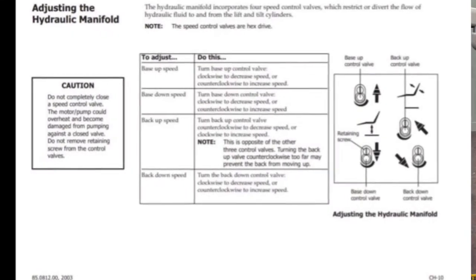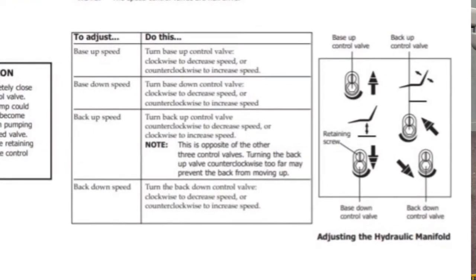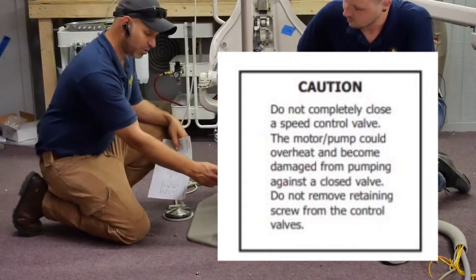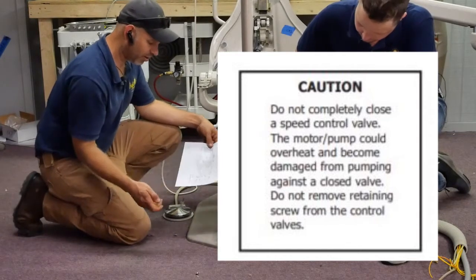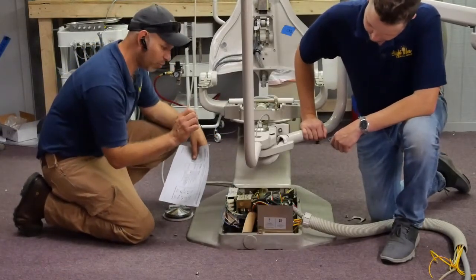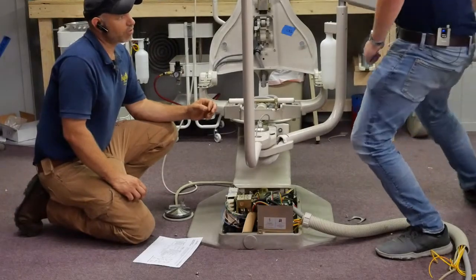Okay, the hydraulic manifold has 4 positions. There's a back up control valve, a back down control valve, the base up control valve, and the base down control valve. Each one of the control valves has a retaining screw that keeps you from screwing it out too far and finding yourself in a literally screwed situation. So this is where we'll demonstrate how these valves affect the chair. Calvin, go ahead and don't hurt yourself.